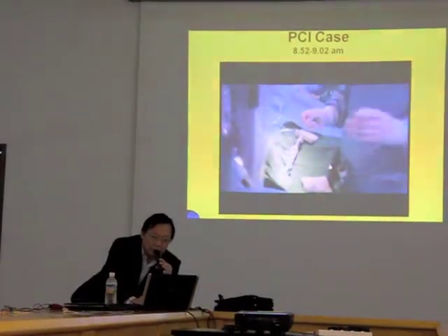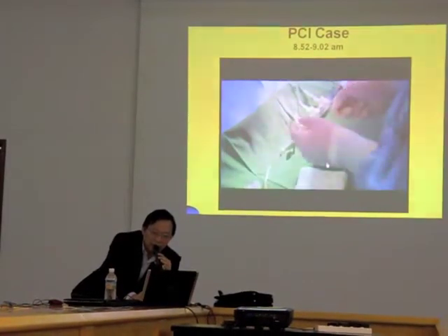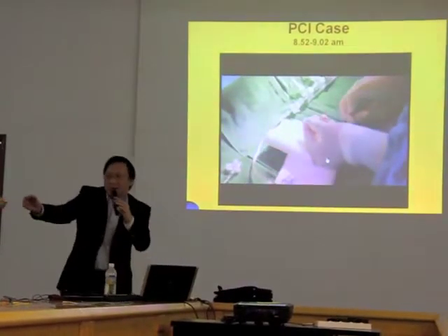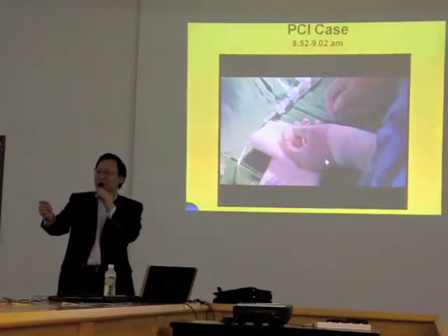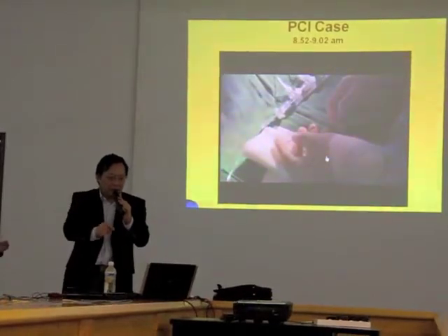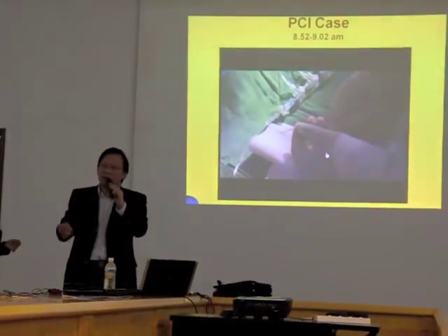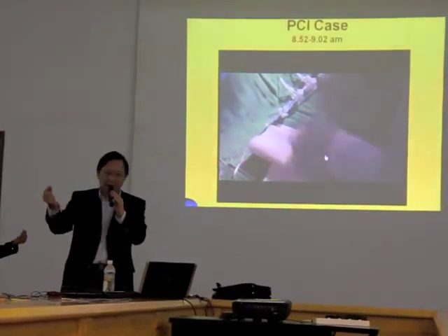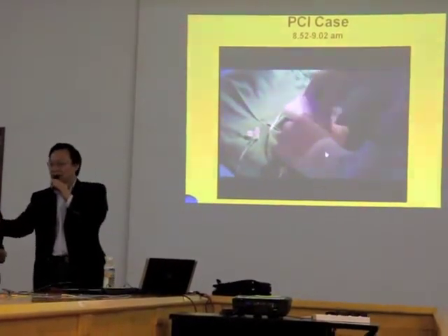What we have to do now is to put a wire. We have a very fine wire — it's a tiny 0.014 inch wire. The tip of this wire is very soft. We make a tiny angle — about 30 degrees, sometimes 45 degrees — so that I can adjust and rotate the other end of the wire, so it will go any way I want.